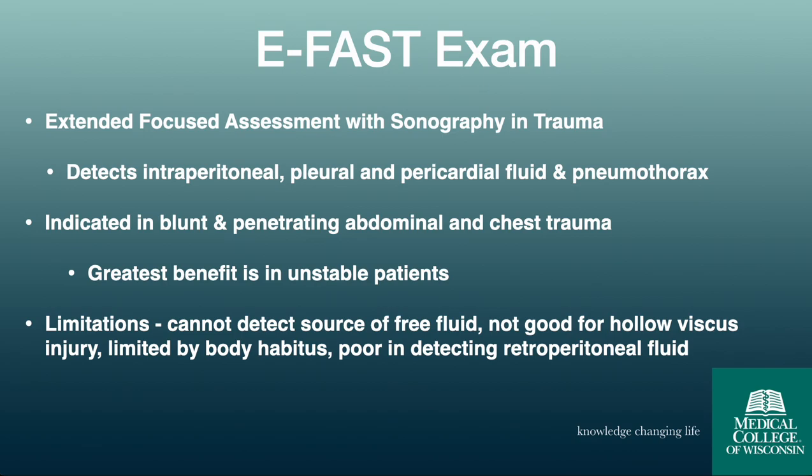Focus our talk on the EFAST exam, which is the Extended Focus Assessment with Sonography in Trauma. Basically, this is an exam that has been around since the 80s, and one of the first exams used in point-of-care ultrasound. It was used to help detect fluid in the abdomen, so intraperitoneal fluid or even pleural fluid, pericardial fluid, and a pneumothorax.